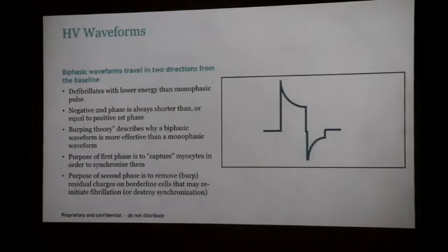It's on the spine, right? Just in front of the spine. And I've never had a DFT failure when I've used it. So I've had some problems with DFTs in some patients, and when you put the azygos vein lead in, is that why you have phased out subcutaneous arrays? Well, it's so much better than a subcutaneous array.